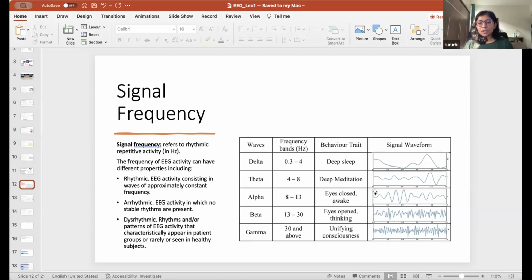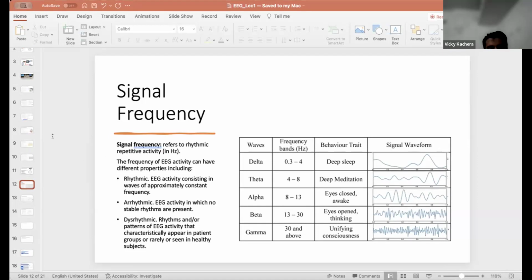Yeah. So imagine you take 10 data points. Okay, let's do that. I took measurements at all of these points between 0 and 1 seconds. I took measurements at 0 seconds, 0.01 seconds, 0.02 seconds. So this is time. इतने बार मैंने measure किया. So my sampling rate is 100. 100 times I measured in a second. Are you showing something? Oh, you can't see? No. Okay, wait.